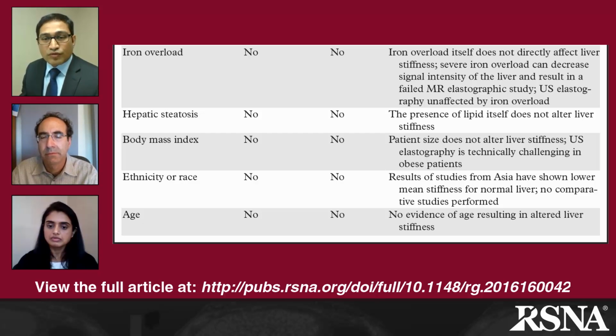So you might wonder, what will you do in those conditions? In those conditions, you might go for ultrasound elastography if need be. Or it so happens in our clinical setup, hemochromatosis patients become very good blood donors because they go for a lot of phlebotomies. And when they go for a lot of phlebotomies, the iron will come down. And once the iron has come down and you're worried about fibrosis, you can do an MR elastography.